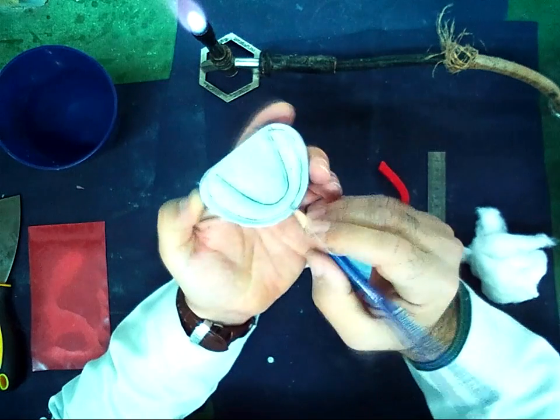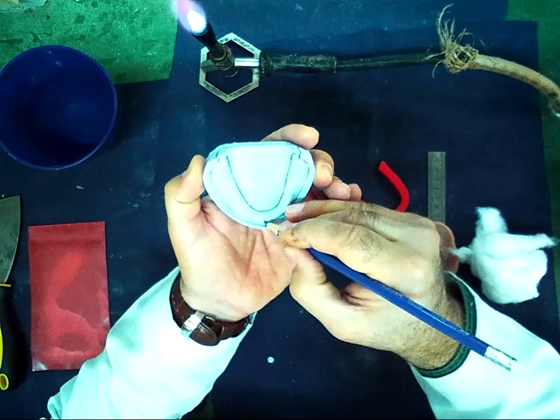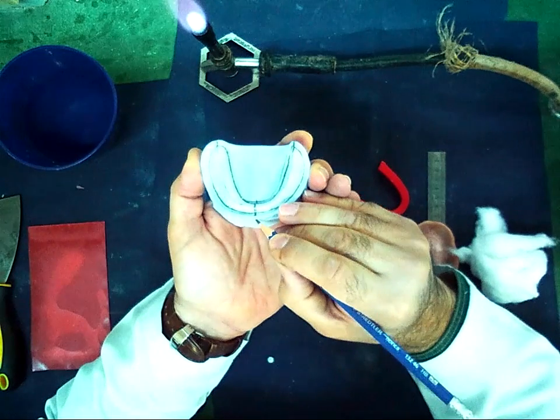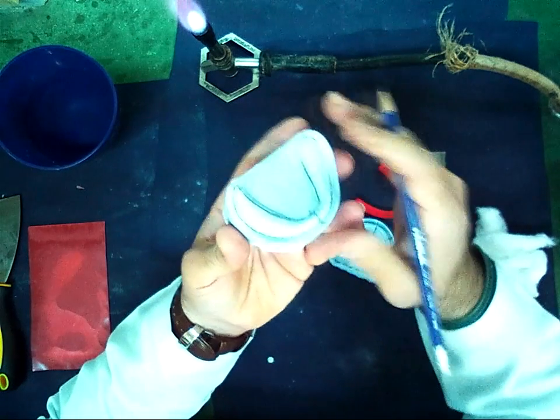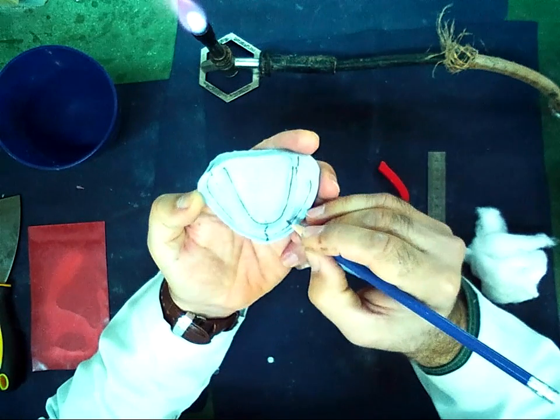Another line, it is the midline. I draw it on the midline of the anterior part. The third line, the canine eminence line. This is the canine eminence.